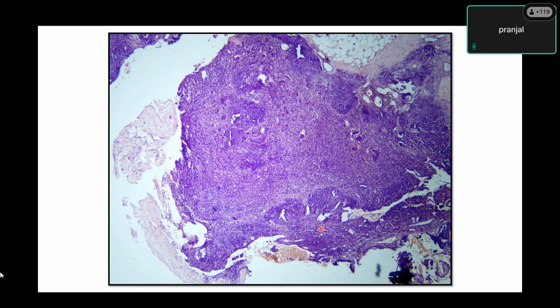Madam, it is specimen from bone, showing a soft tissue mass from the bone, showing the stroma with mostly spindle cells. Very good. It's showing some lighter areas and darker areas in between. Very good. So you are seeing some lighter areas and some darker areas, right? Anything else you would like to elaborate upon?